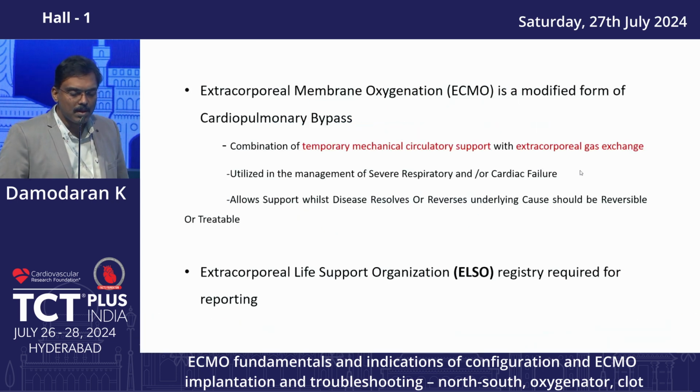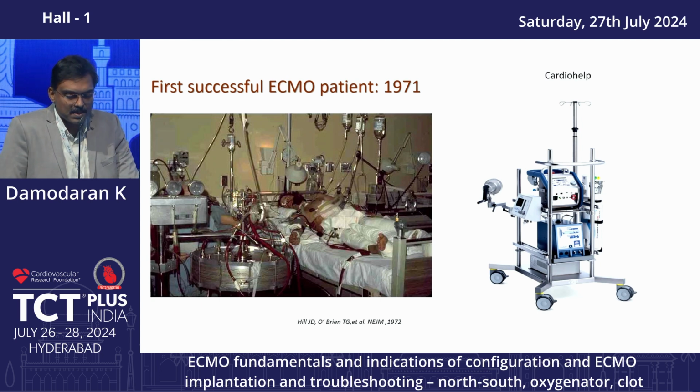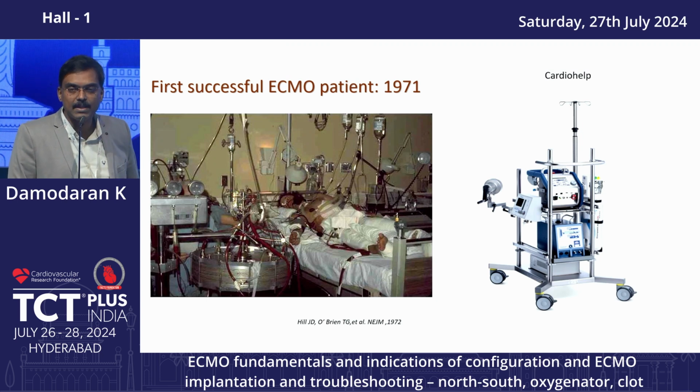ECMO is a modified form of cardiopulmonary bypass. Basically, it is temporary mechanical circulatory support with extracorporeal gas exchange. There is an organization called ELSO, founded in 1989, which keeps the registry of real-world patients. You can see the first successful ECMO patient. There were a lot of gadgets around and no space to move, which has transformed into a miniaturized portable device, which is being used nowadays even in the area of arrest, even outside hospitals.